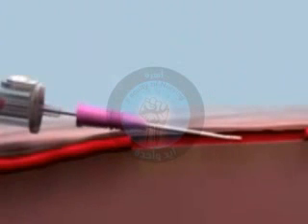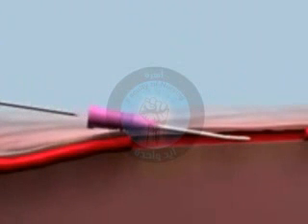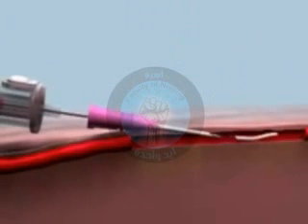Never attempt to reinsert the metal needle into the plastic cannula. Doing so may shear off the plastic cannula, releasing it into the bloodstream, resulting in a possible embolus.